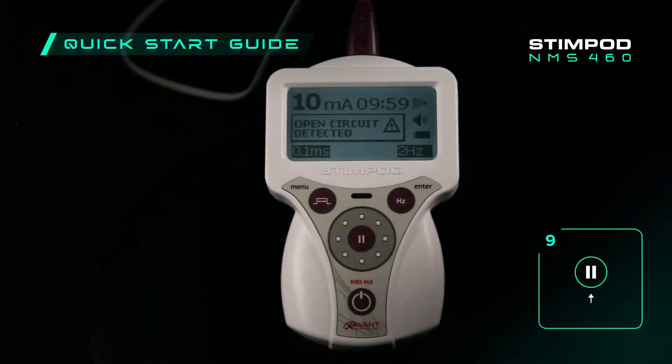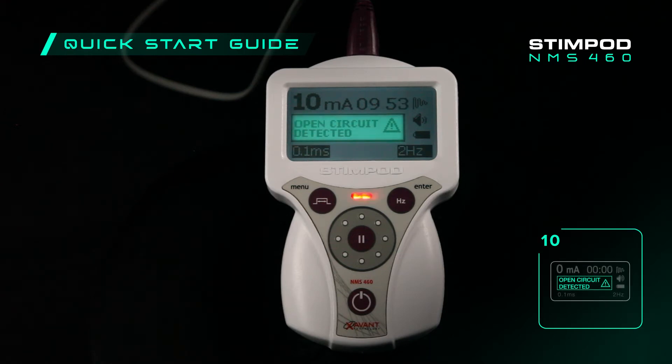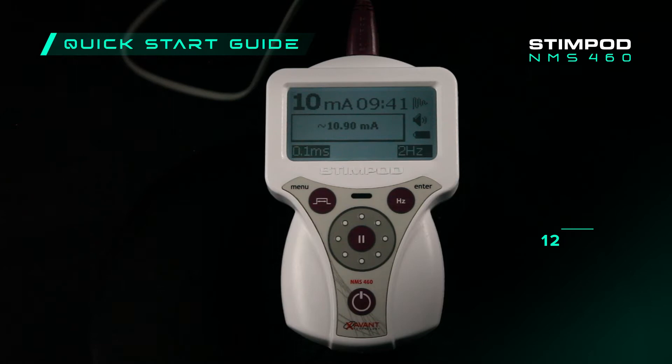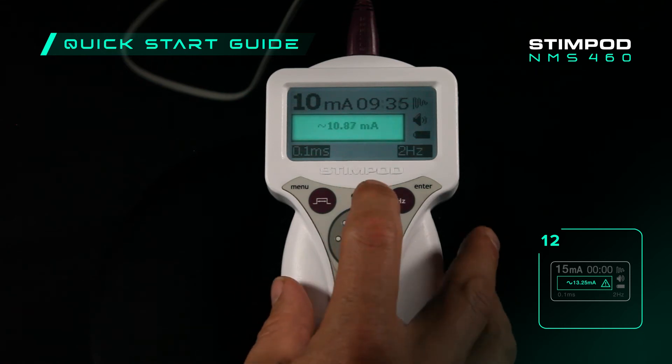Press the pause button to start the stimulation. The StimPod's indicator LED will begin to flash red, and 'open circuit detected' will be displayed on screen. This status message will remain until the treatment probe makes contact with the skin. Now apply the treatment probe to the treatment area — once the treatment probe touches the skin, the StimPod will start to beep, the LED will flash green, and the average current delivered will now be displayed.